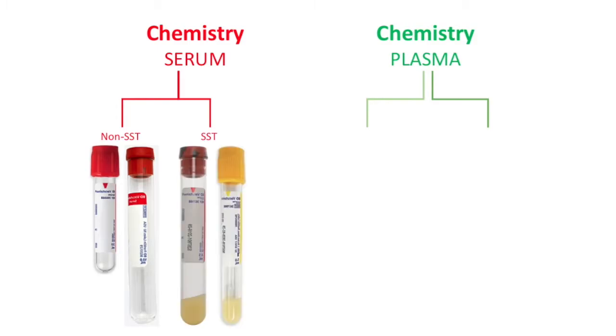And then we have our serum separator tubes, or our SSTs. We have our tiger top, otherwise known as the gray-red speckled top, and our gold tube. Now you can see down here, this includes a thixotropic separator gel. This is what separates the blood cells from the serum portion of the blood. So that's how you know it's a separating tube. This is an SST, serum separating tube.